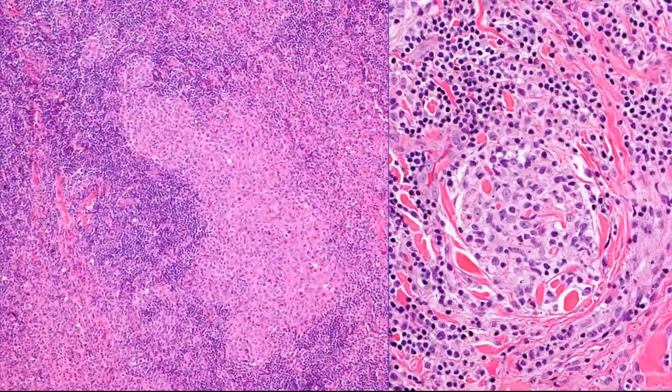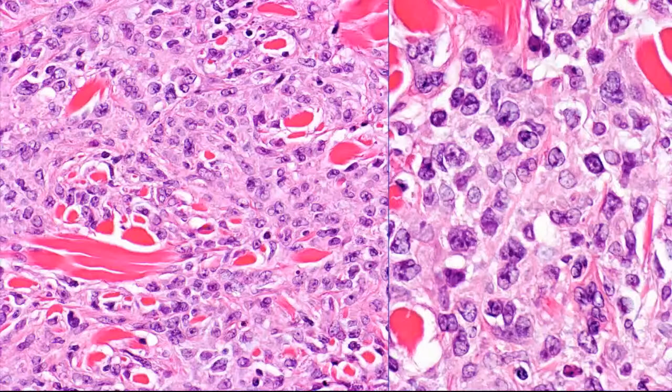In some areas in the infiltrate, you could see that there are atypical follicles. And here's an irregular follicle here. Here's a small round follicle, but they don't have the composition of reactive follicles. They look atypical, and there's some overlap with what we saw in what appeared to be a diffuse component morphologically. And then in other areas in the diffuse component, we just take a good look at these atypical cells.